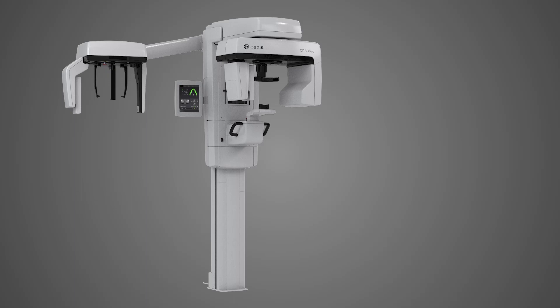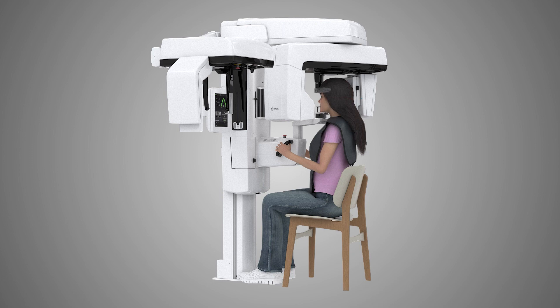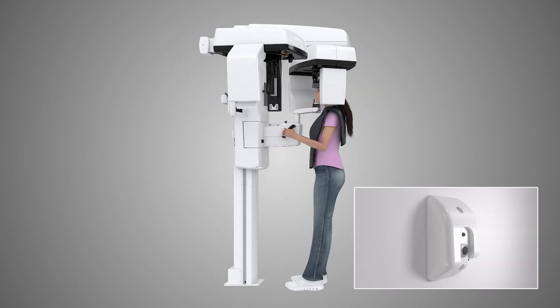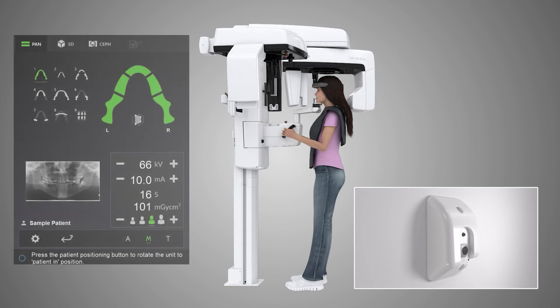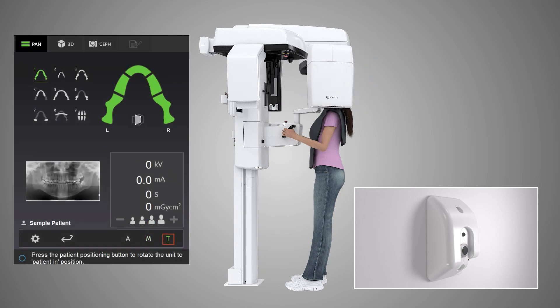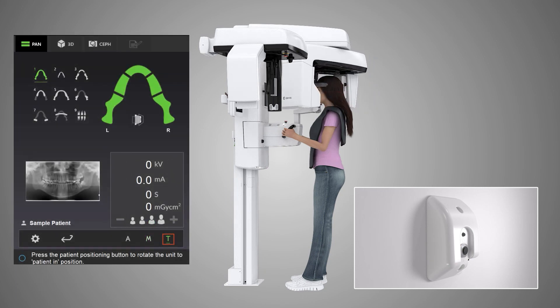Additional information: exposures can also be taken in a seated position. If you would like to show the patient how the rotating unit works, or if you are concerned about the clearance of the patient's shoulders, you can use test mode using the test icon on the touch screen.